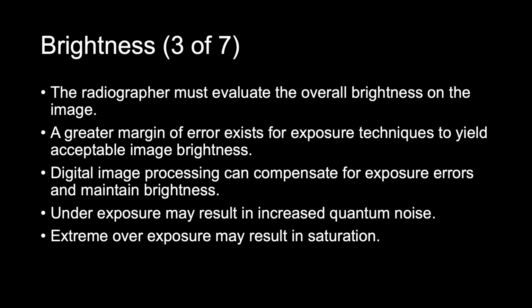The radiographer must evaluate the overall brightness on the image to determine whether it is sufficient to visualize the anatomic area of interest. He or she then decides whether the radiograph is diagnostic or unacceptable. In order to evaluate other attributes of the radiographic quality, such as the contrast and the sharpness, the image must have sufficient brightness to visualize the anatomic area of interest.